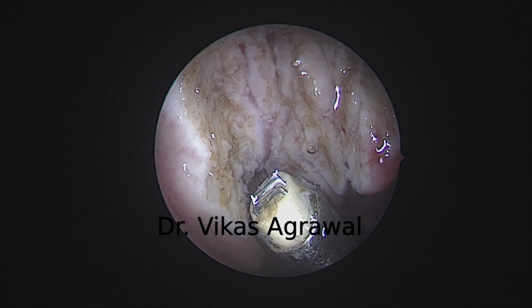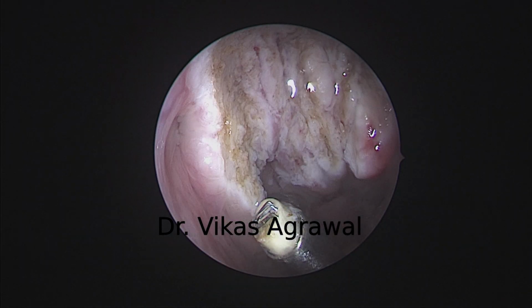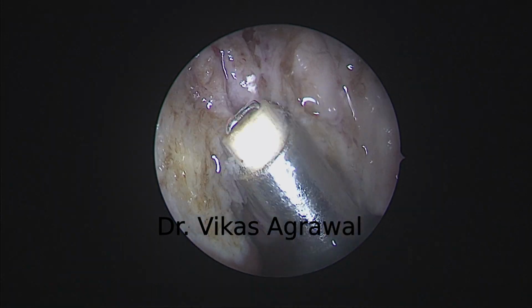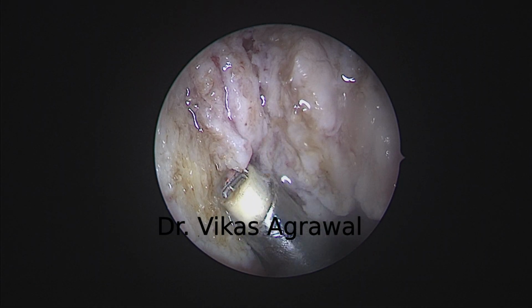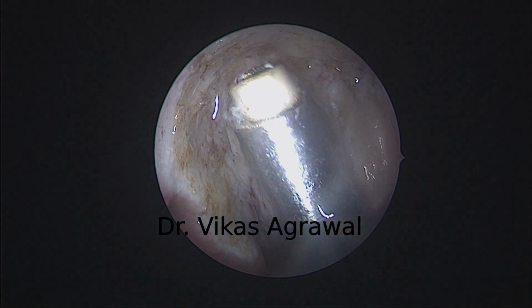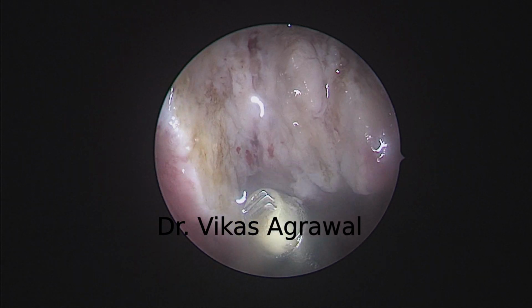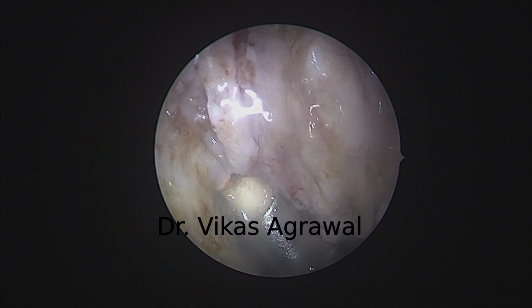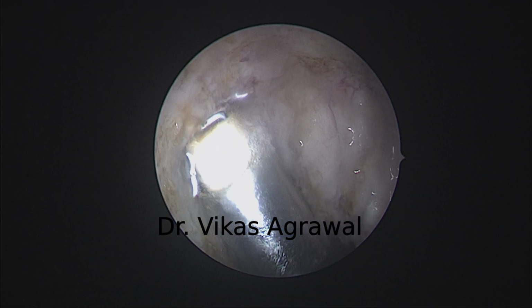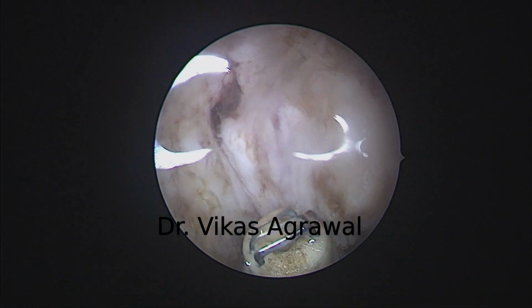And now you can see, you do not have to open up the muscle. See, this is submucosal. I have not opened the muscle, I have not exposed the muscles also. That is the lateral boundary anteriorly, right? I have remained away from the eustachian tube. And now I am going for the fossa of Rosenmuller, which is the lateral boundary posteriorly. So these boundaries were defined first time by our paper in 2016.